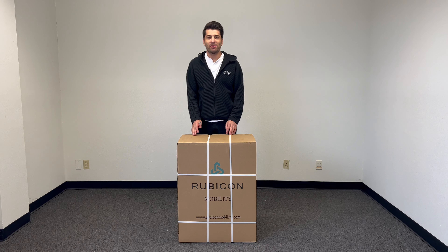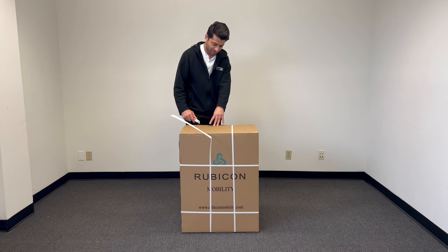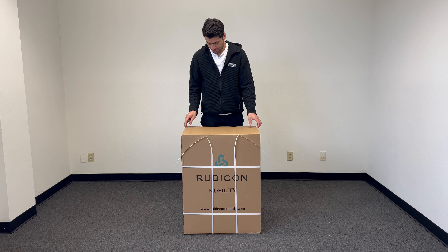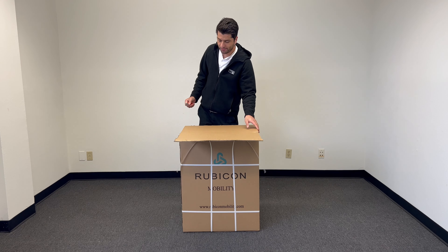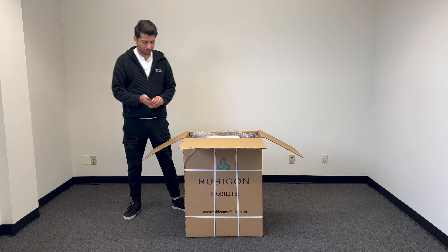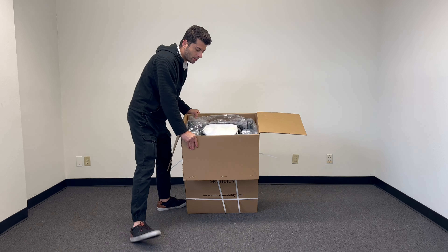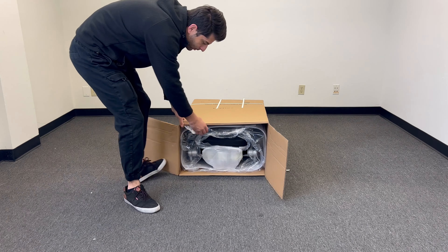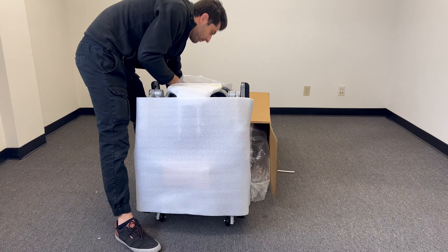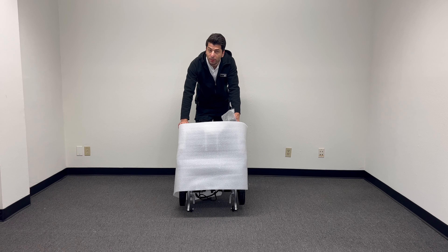Today we just introduced this six-foot chair and let's just open it. I will show you, when you are alone, how to remove it from the box. Once we open it from the box and remove it, we'll open it and we'll see what we've got.